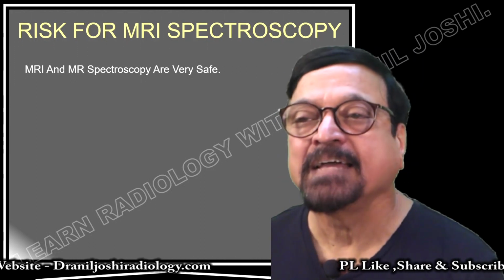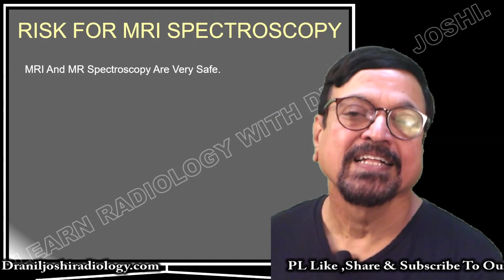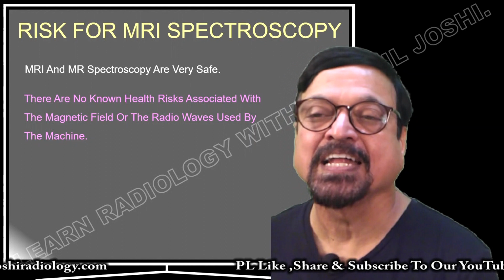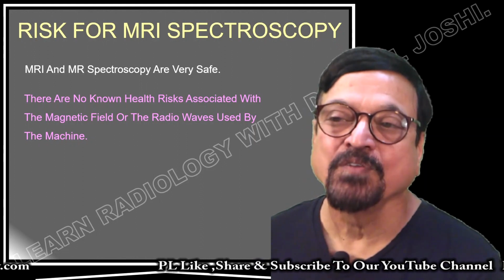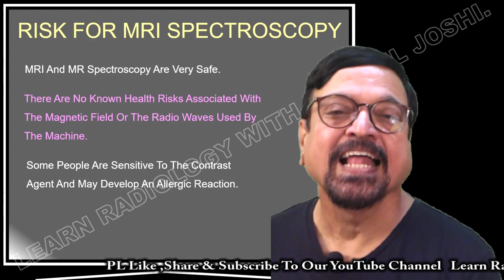Now MRI and MRI spectroscopy are extremely safe. There is no additional risk to the MRS after MRI is done. There are no known health risks associated with the magnetic field or radio waves used for the machines. They are absolutely operated within health limits.